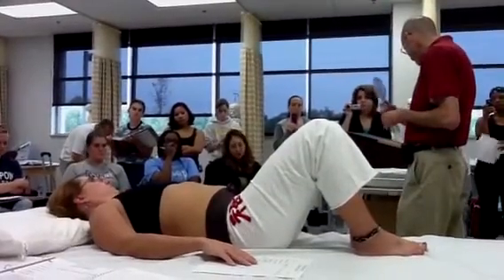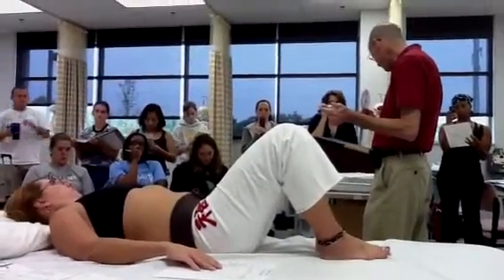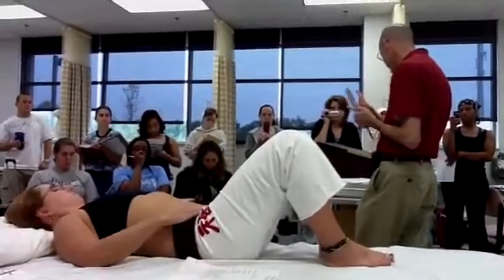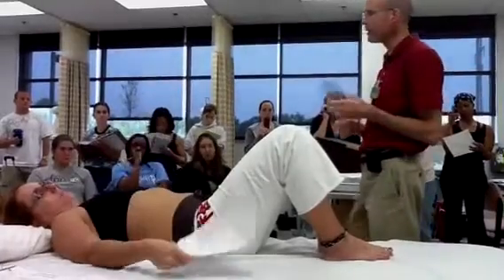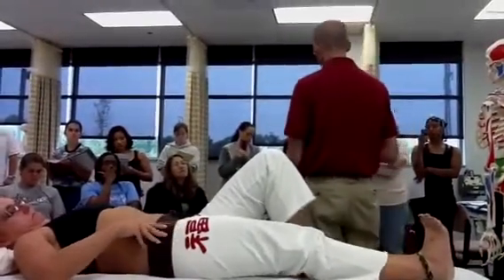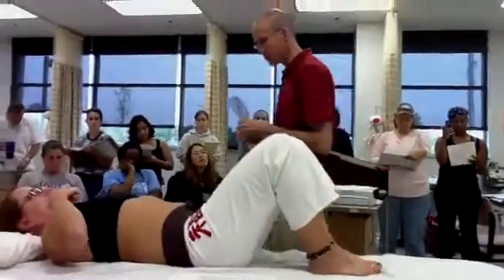All right. And then number 5 is accurately align the goniometer, and you're going to have the patient attempt active range of motion. Number 7, you're going to measure both active and passive if there's a significant difference. All right, for this skills test, active and passive is going to be the same thing. So just think about you're measuring active range of motion.